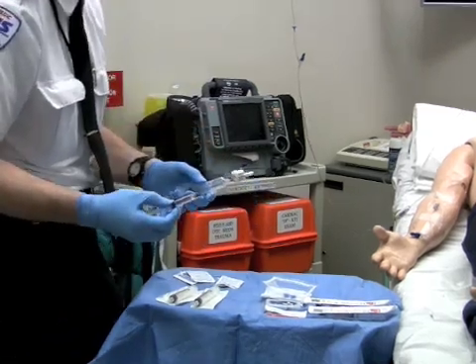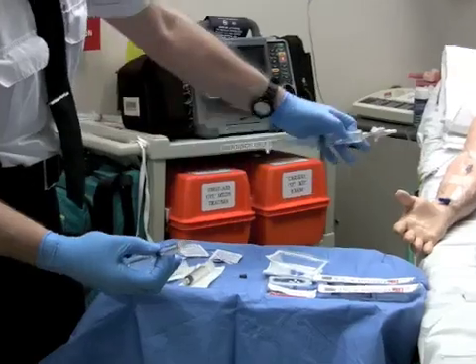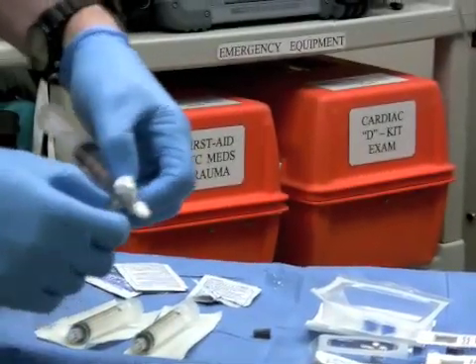The first 6mg challenge to the patient is to take the glass syringe, which was incompatible and still is with the clave, and put it into this one, which is compatible. Lock all of that in.